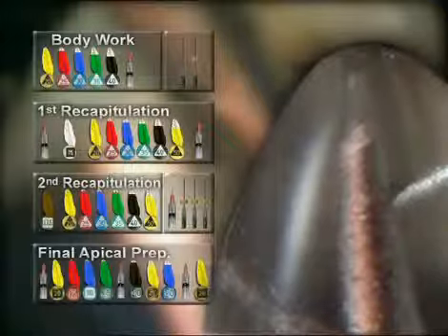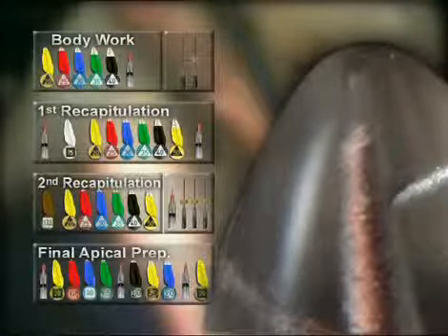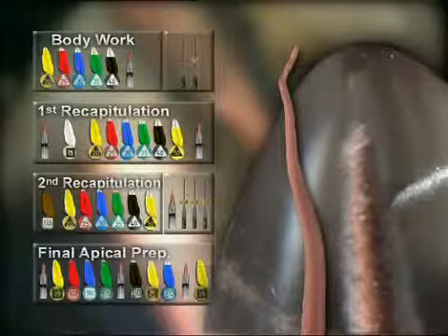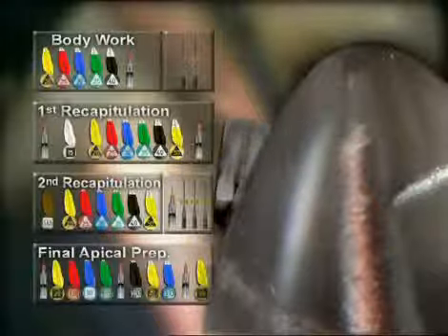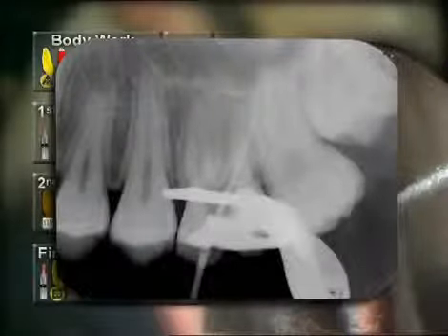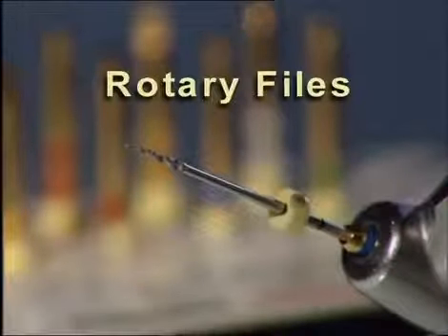Tuckback refers to the tactile sensation of apical snugness. The cone shouldn't look crinkled after removal. In this case, the selected cone was either too small or the canal wasn't shaped properly. A diagnostic film confirms the master cone's position. Before packing, the master cone is cut back 0.5 millimeters from the canal terminus or consistent drying point.